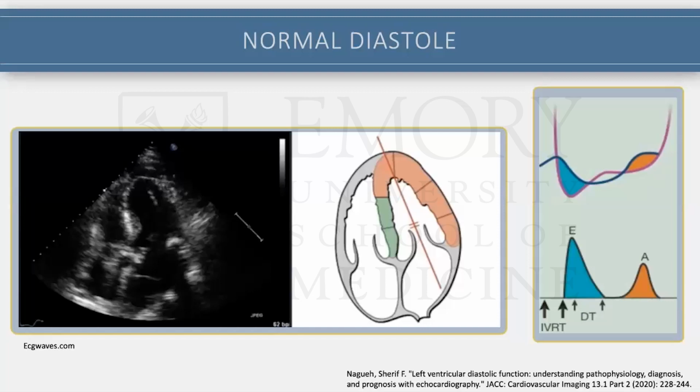This slide is really more for people who haven't done their echo months yet or haven't done much of it. One thing we can do to measure flow from the LA to the LV through the mitral valve is use pulse wave Doppler, basically telling the echo machine to focus on a particular point on the screen to measure flow and velocities.